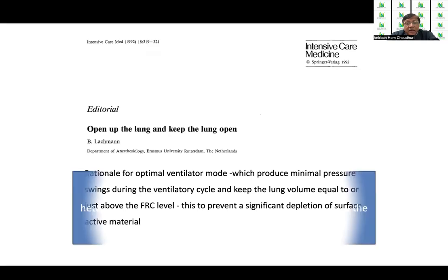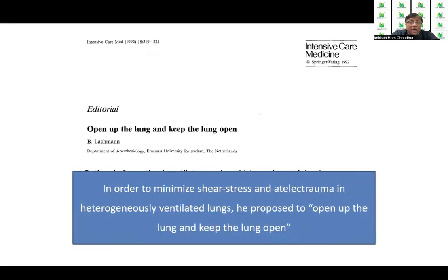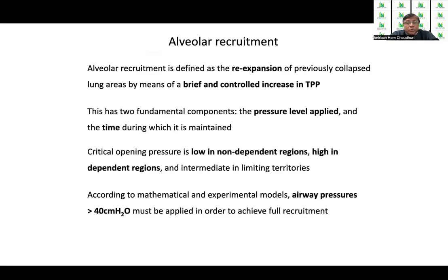So this led to the concept of the open lung, in order to minimize the shear stress and atelectrauma for those alveoli which are not opening. The repeated closure and opening of those highly non-compliant alveoli can generate shear forces and cause damage to them, irreversible damage, atelectrauma. So it was proposed by Lachmann that we open up the lung and keep the lung open. That's how it came to be the open lung approach.